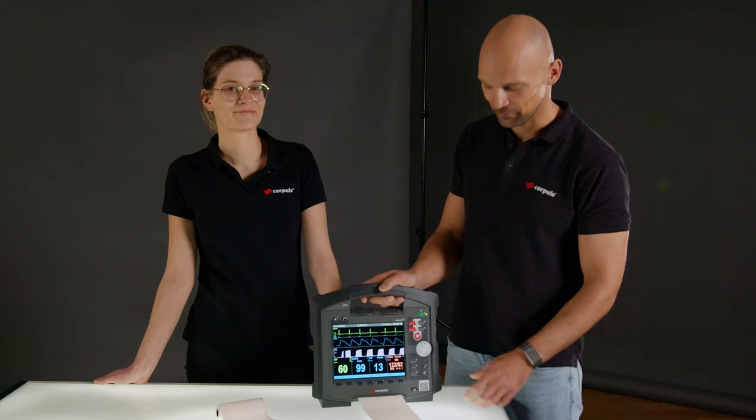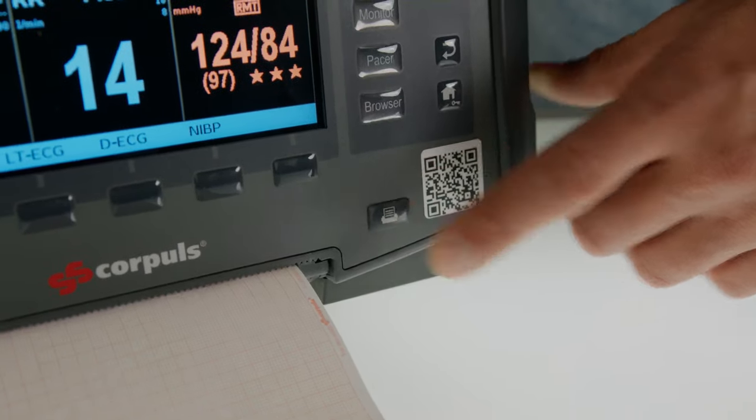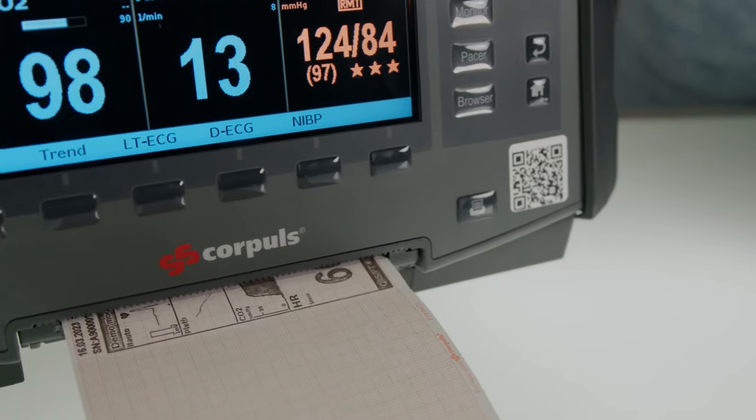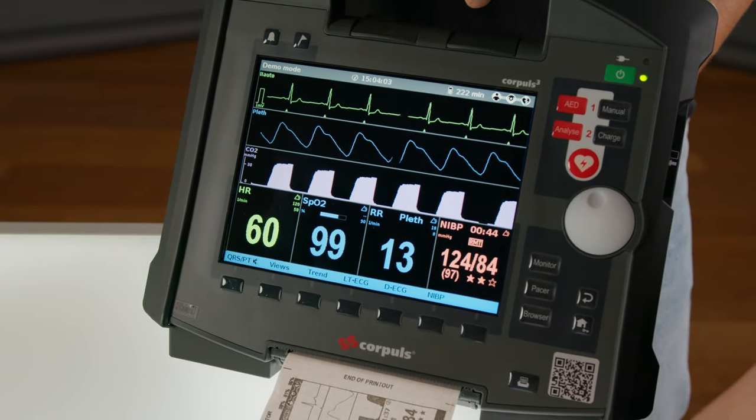Now we have the possibility via a screenshot to create a test print. With the help of the screenshot, you can check the print quality.